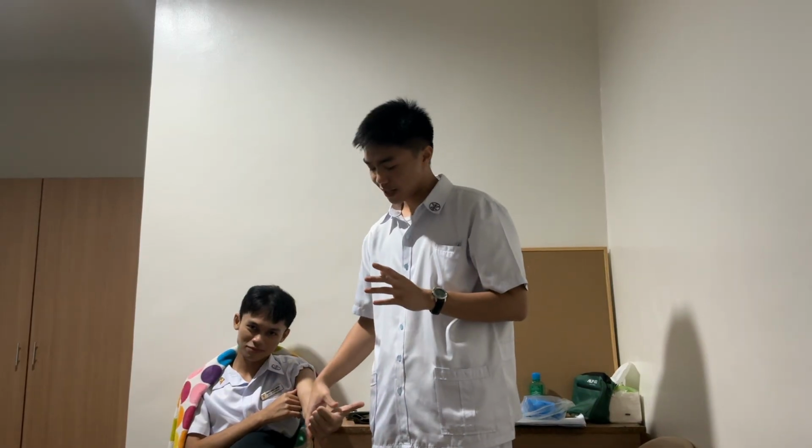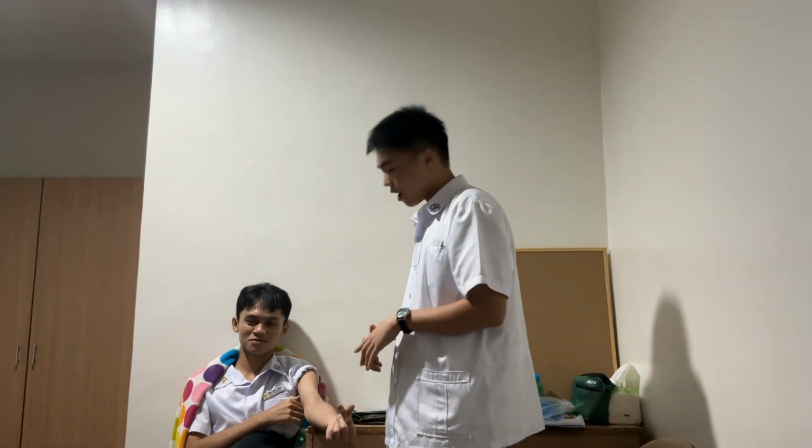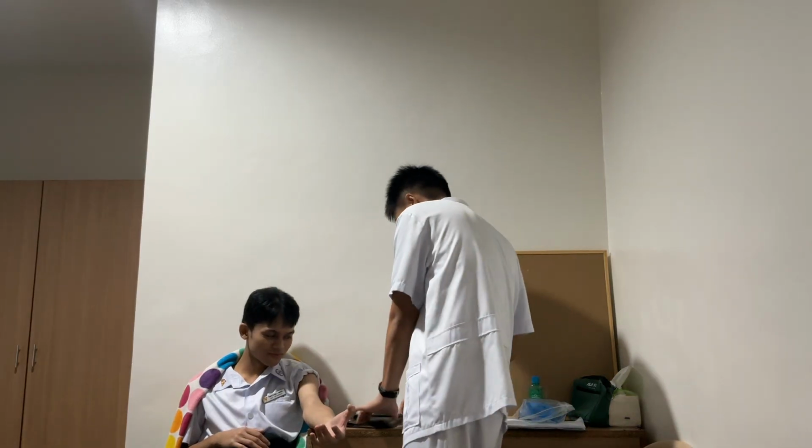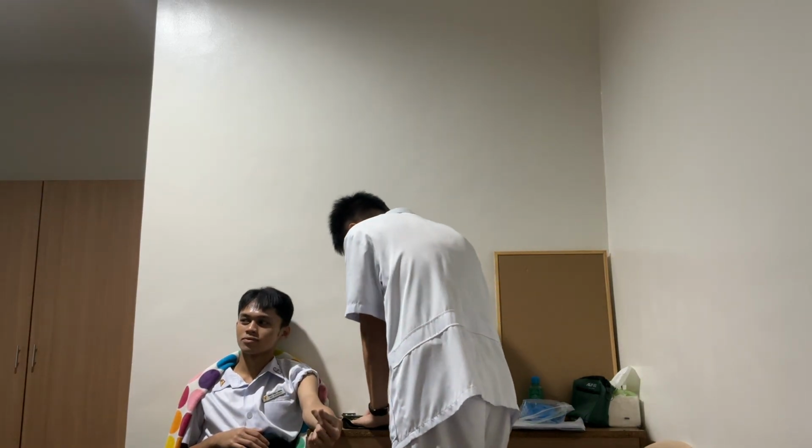So, once that's done, we have to ensure the hand is also facing upward. Once the hand is facing upward, and then the arm is at heart level, so that the flow of blood will be normal, and there's no difficulty or struggle due to gravity or whatsoever. Now, when we have exposed the arm already, we can start to wrap the deflated cuff. Ensure that it is deflated.